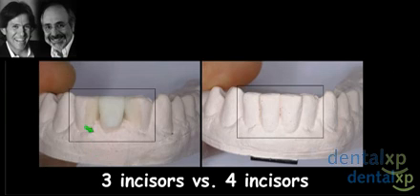2 implants? This is a challenge because obviously what's nice is doing the wax-ups from a restorative standpoint gives me a lot of information, gives David a lot of information. What we're able to do is show the patient that we would need to do either small veneers, which will be highlighted tomorrow in a webinar by Christian Coachman, and a single implant, or do 4 incisors and then have to reconstruct two very small diameter teeth.